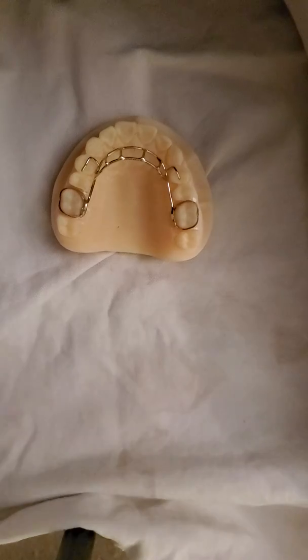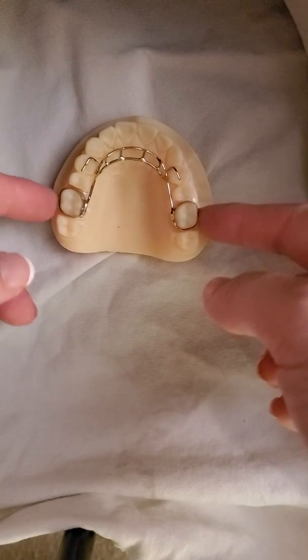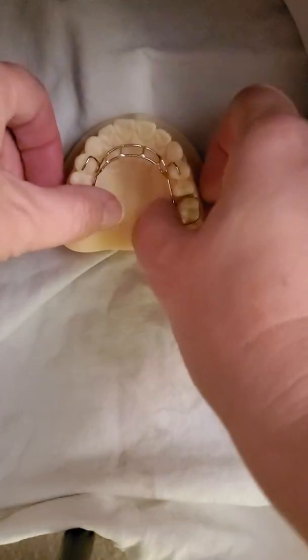So this is the appliance. You can actually solder on the bands. You can solder on some tubes if you want to connect braces to it, or you can just wear this independently on your own. For about 6 months would be the minimum I would wear it.